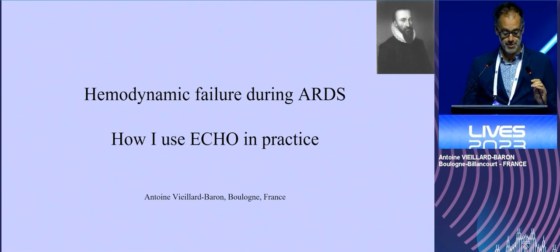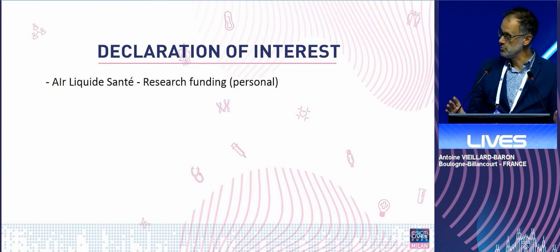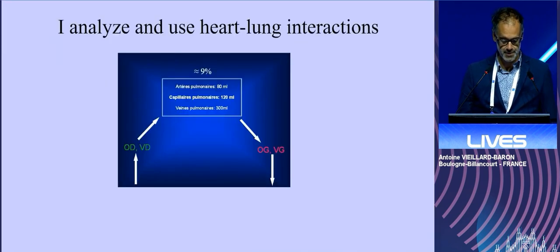So yes, how I use echo in my practice. I will be very practical, but with some physiological concepts very well re-emphasized by Michael, my conflict of interest. First, I use echo in ARDS patients because I want to analyze and use the heart-lung interaction to improve my patient's management.